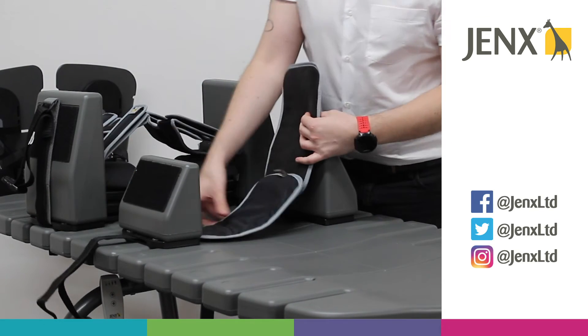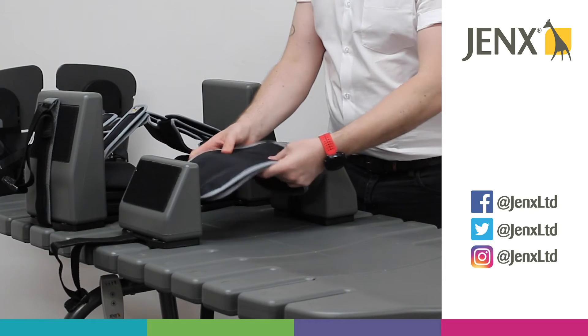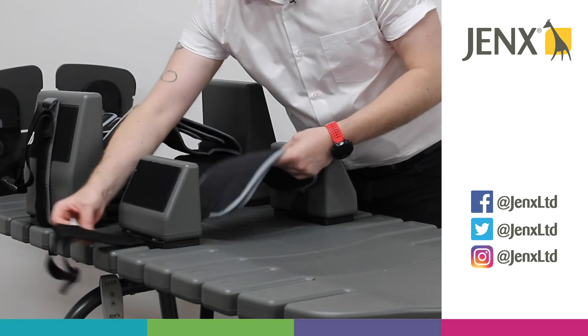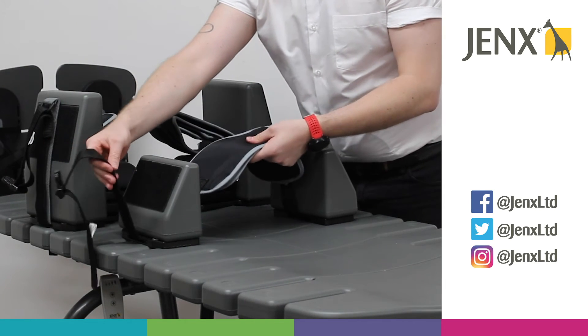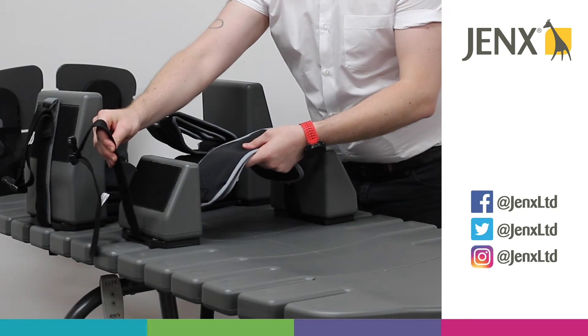For the pelvic strap, we have two velcro straps. We want these to go over the pelvis, around the ASIS. Once that's in place, we can then adjust the strap for any rotational issues that we may have.